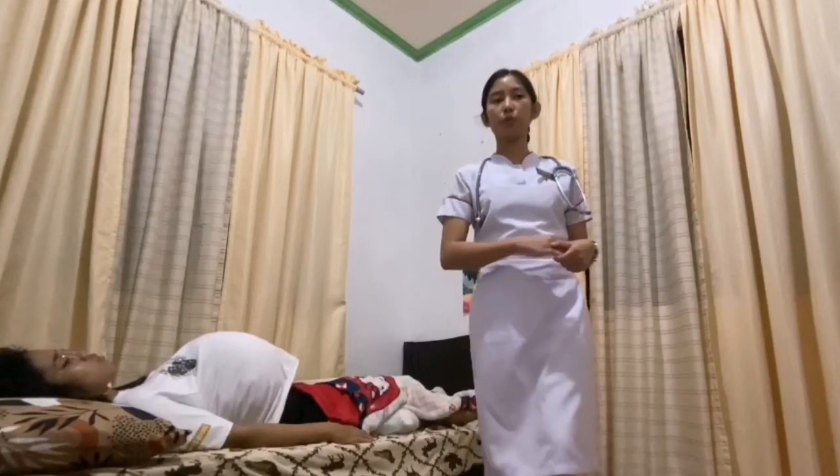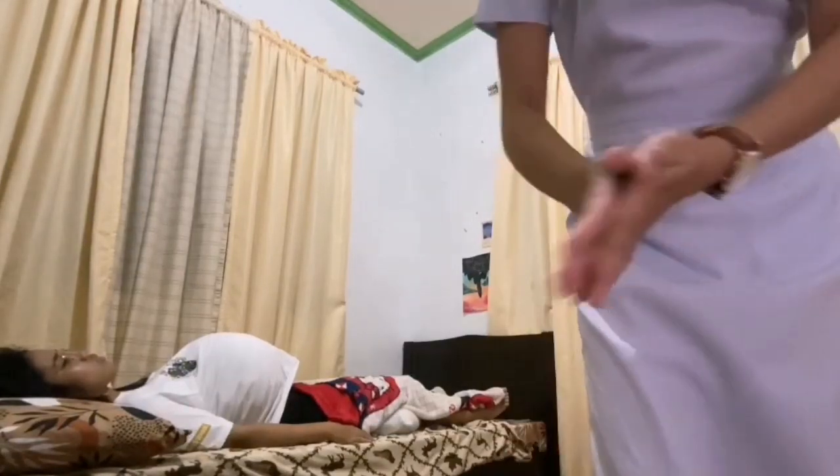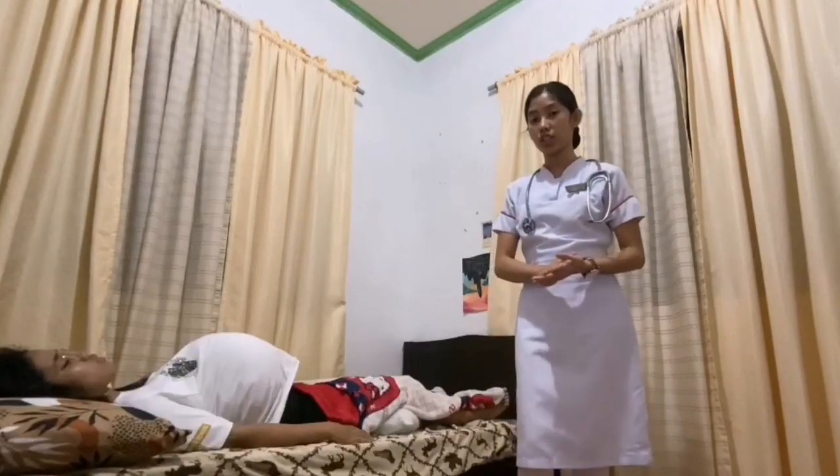So for the taking of fetal heart tone using the stethoscope, the first thing that I am going to do is to wash hands in order to avoid the spread of microorganisms. After that is to explain the procedure to the patient, as listening to the baby's heart rate is a routine assessment periodically to check the baby's condition.